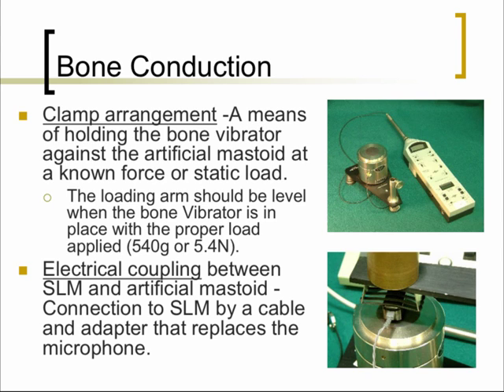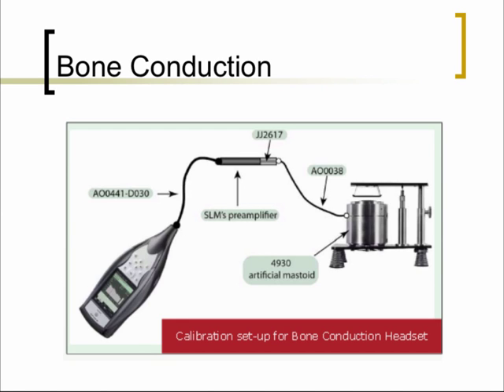With the clamp, you simulate the tension the headband places when the bone vibrator is on the mastoid — approximately 540 grams. The band helps confirm you're maintaining that tension. This is an electrical coupling, not an acoustical coupling, between the sound level meter and the artificial mastoid. The connection to the SLM by cable replaces the microphone used for the rest of calibration. The artificial mastoid converts the mechanical vibration into electrical equivalent, fed to the sound level meter to be measured.